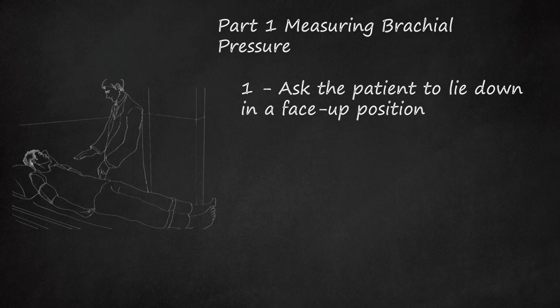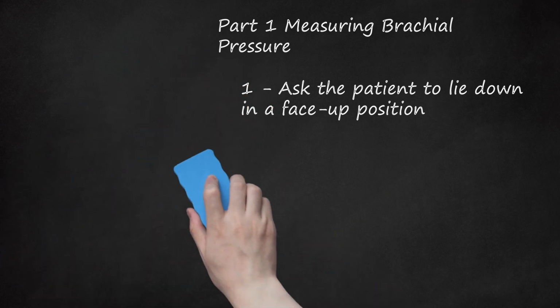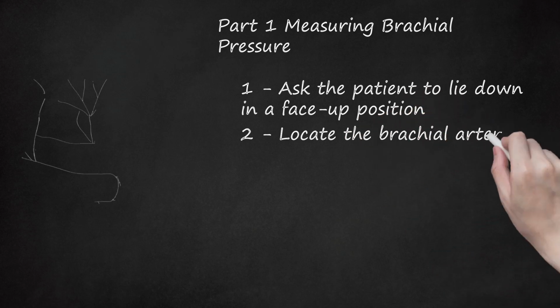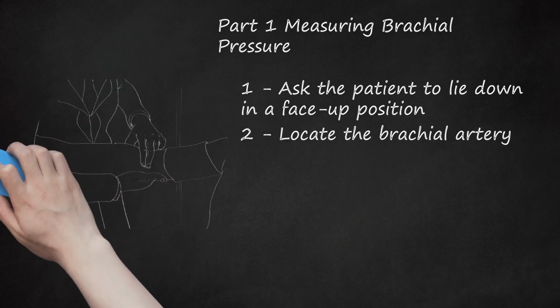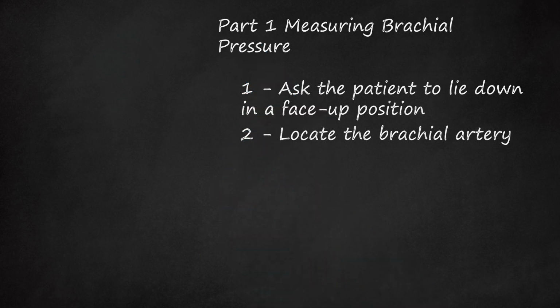Resting will help his blood pressure to normalize, particularly if he is anxious, while also allowing the heart and brachial pulse to level out. Both of your patient's arms should be exposed. Any sleeves should be rolled up loosely and out of the way. 2. Locate the brachial artery. Use your index and middle finger to locate the pulse site. Do not use your thumb because it has its own pulse that could make finding your patient's pulse more difficult. The brachial pulse is usually felt just above the antecubital fossa, the middle part of the elbow bend.